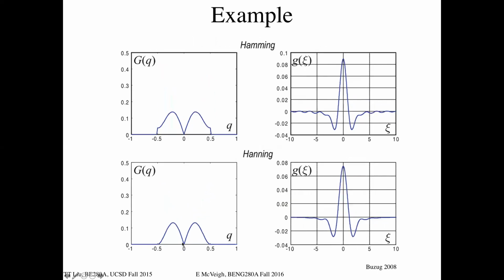And then here's one, which is a Hanning filter, which is ultimately smoothing in that it not only goes to 0, but its derivative goes to 0. So it curves down, and so you downweight a lot of this high frequency stuff in order to make a smoother, quote unquote, better looking picture. Okay? So you'll take some of that blurring back in order to reduce noise.